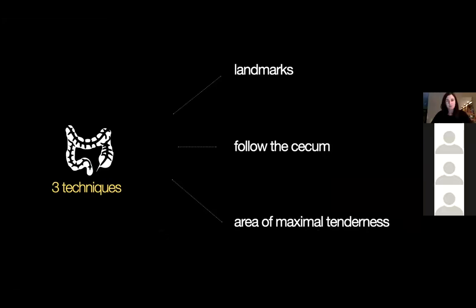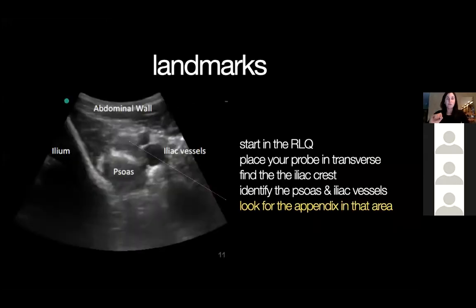The follow the cecum is more for the fellows in focus, but also the experts, because it takes a lot of skills to actually follow the cecum all the way down to where you think the appendix might insert. Yes, it's still a good technique to try. And then the area of maximal tenderness, my personal favorite, and I think this is something you should have in your pocket. So let's go over the landmarks technique.